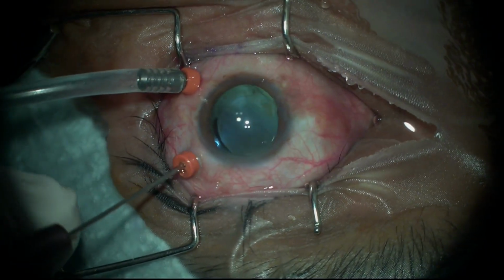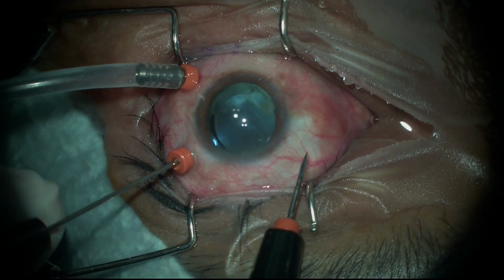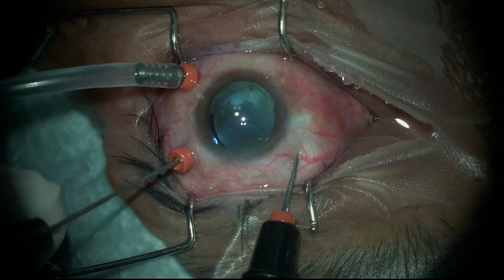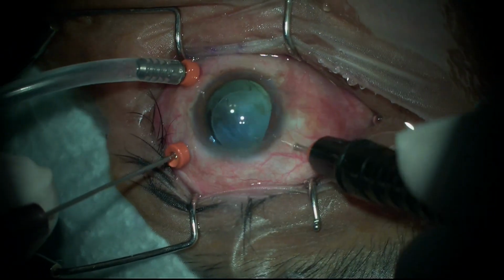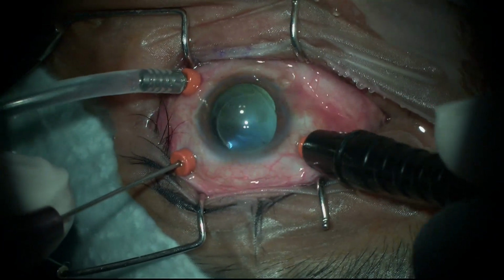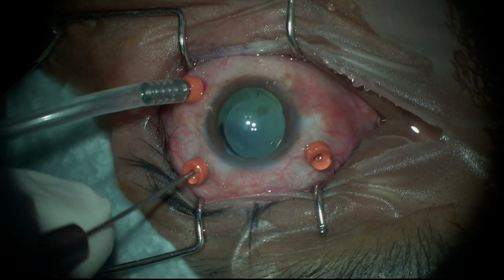But this is possible only if you have a turgid eyeball. Again, you have nearly a 0-degree angle of entry, maybe 10 degrees or so.